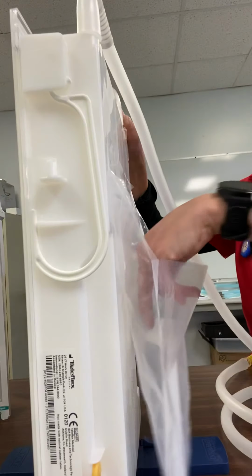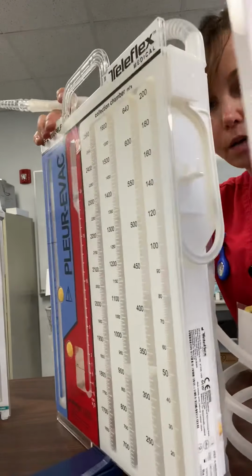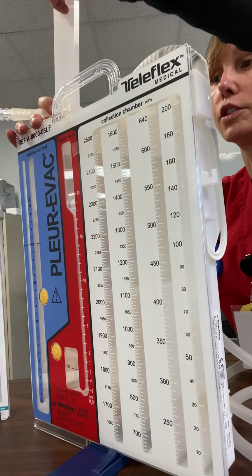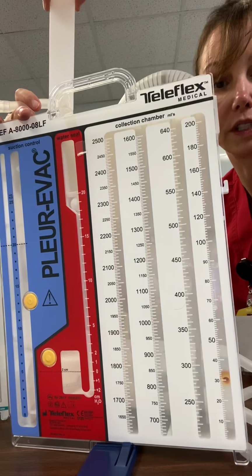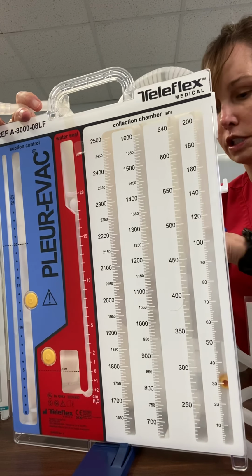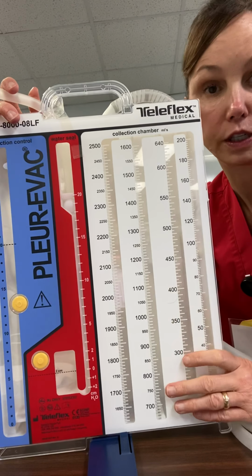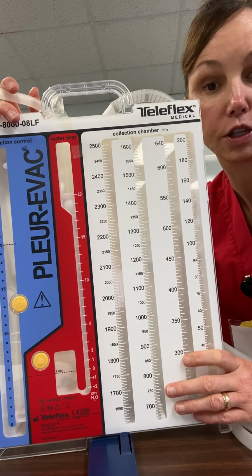Now, on the back of this, it comes with a little cylinder here that you can put on top and fill your chambers with sterile water. Usually the person who sets up the chest tube does that before the chest tube is inserted. So that may be something you may do as a nurse.